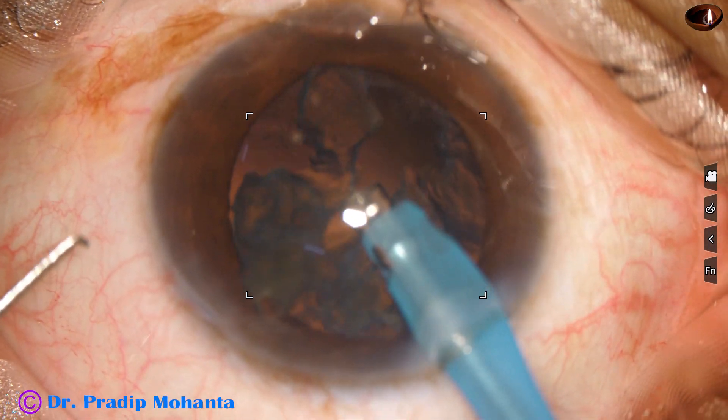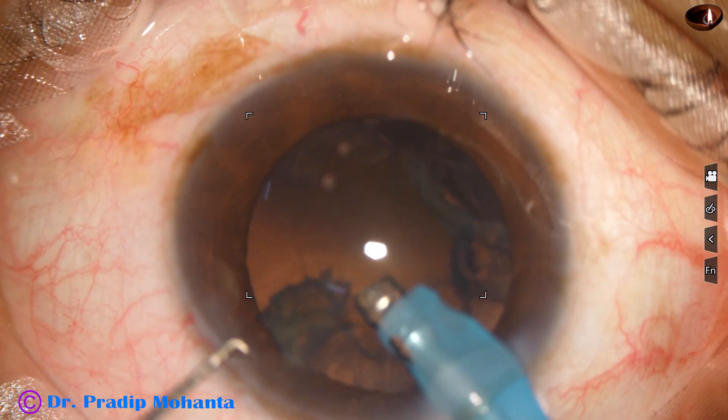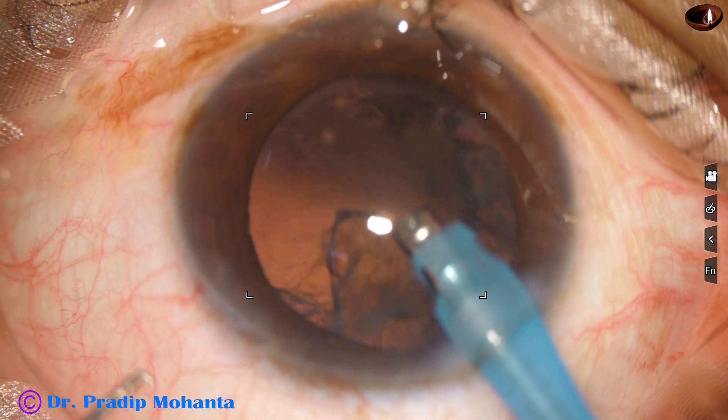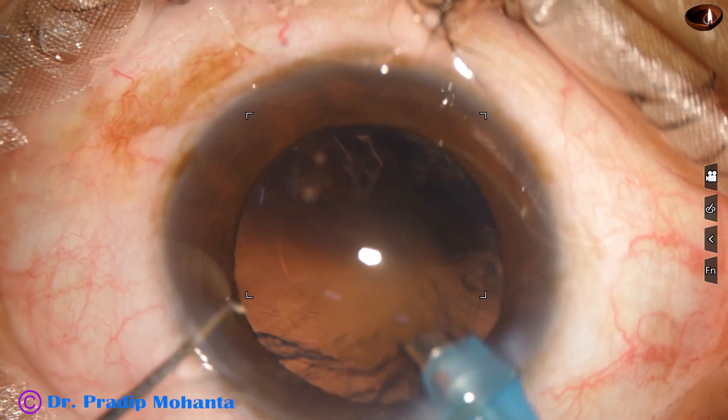And this is the last portion of the nucleus, and the nucleus is nicely managed.